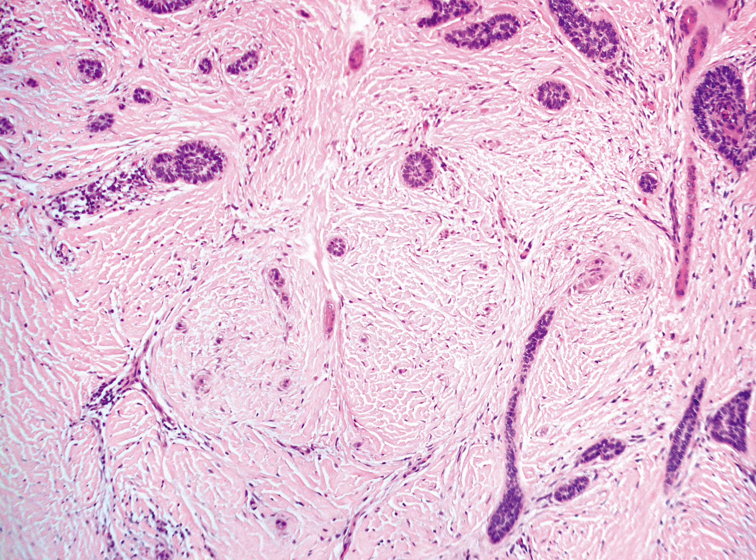This is showing a scar-like plaque on a patient on the temple, and this is a sclerosing morpheaform form of basal cell carcinoma, which is characterized by thin cords of basaloid cells surrounded by very abundant collagenous stroma. The differential diagnosis for this entity includes desmoplastic trichoepithelioma and microcystic adnexal carcinoma. One is benign and the latter is malignant.